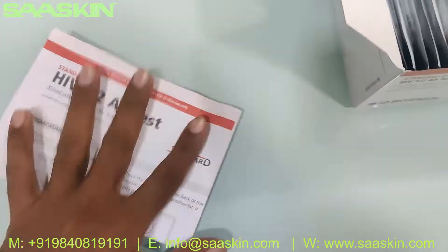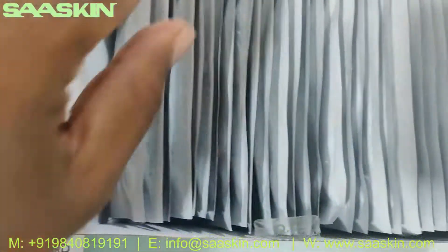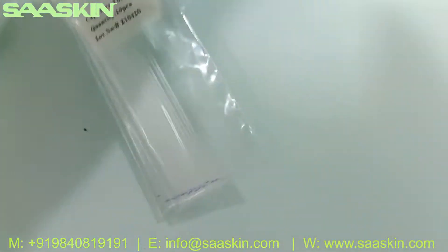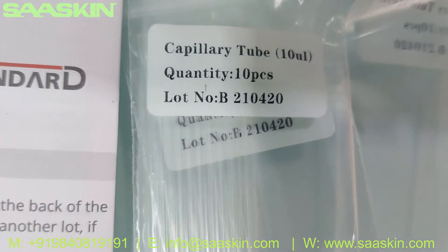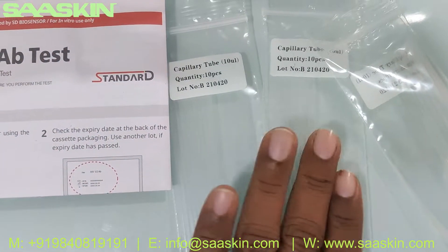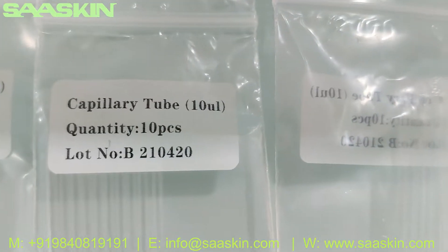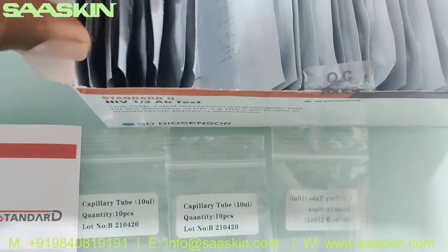Inside you can see there are 30 test cassettes. You get 3 packs — each pack of 10. You also get 3 packs of specimen transfer device. Here you can see the 3 packs of specimen transfer device, which is a capillary tube. We got 30 numbers of that.